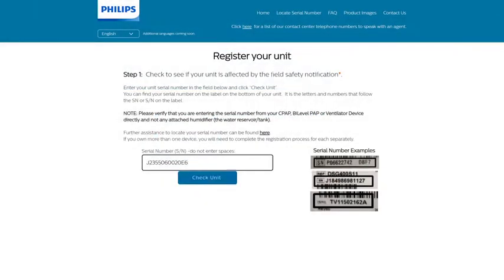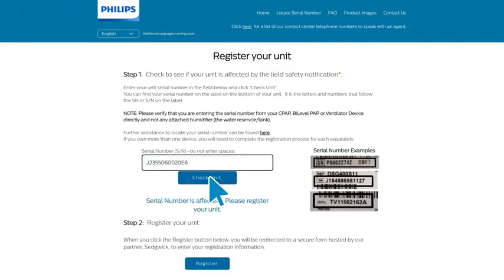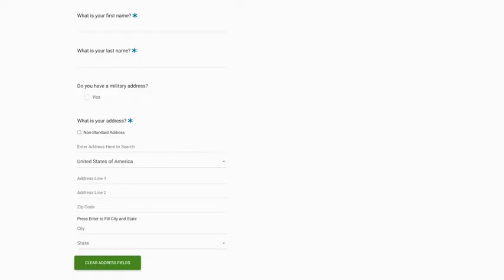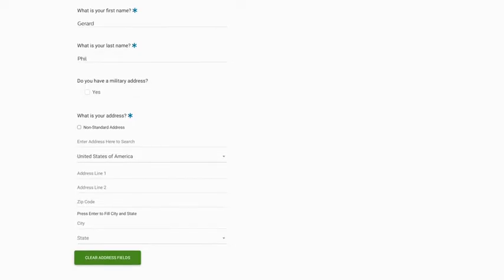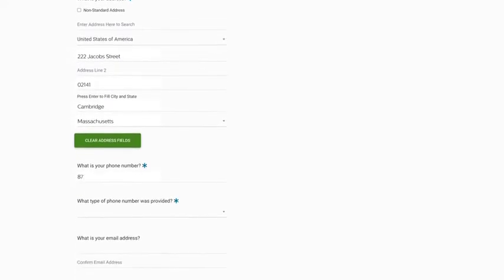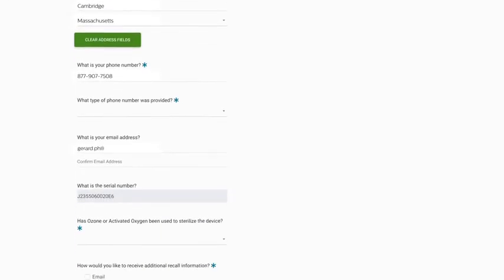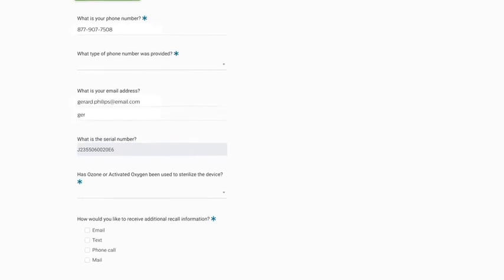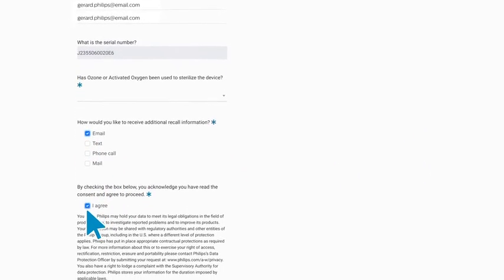After typing in your serial number on the web page, click on 'Check Unit' to see if your device is affected. If your device has been identified as affected, continue the registration process by providing your full name, address, phone number, and email address to complete your registration.